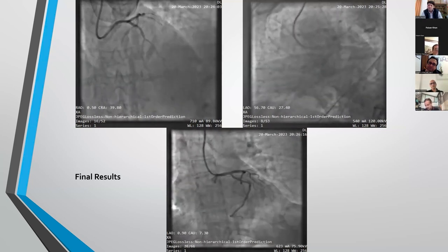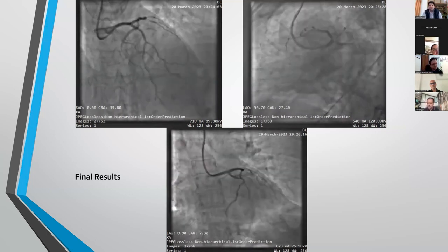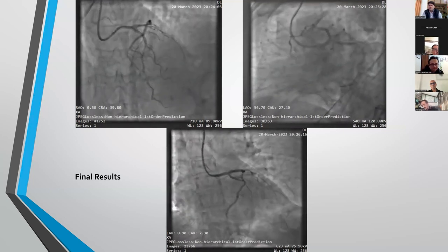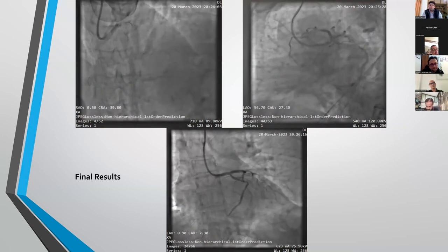कि अगर आपका 6 millimeter square से ज़्यादा आ रहा है, I mean there's a study on 7.5 millimeter square, there's a study on 6 millimeter square, and there's an Asian data on 4.8 millimeter square, but generally I use the 6 millimeter thing. अगर उससे ज़्यादा आ रहा है तो you can safely defer. अगर उससे कम आ रहा है तो you cannot say that is significant.